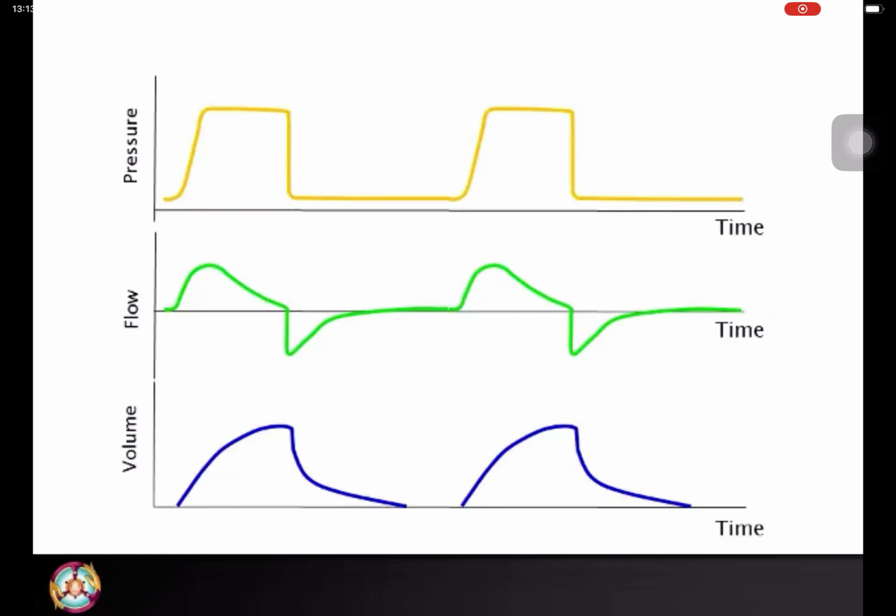A constant pressure is applied to the endotracheal tube during inspiration. This results in a high initial flow, which falls during inspiration. As a result of this flow pattern, oxygenation may be improved. As the pressure is set and the inspiratory time is set, changes in resistance and compliance will result in changes in volume. It is therefore important to monitor the tidal volume.